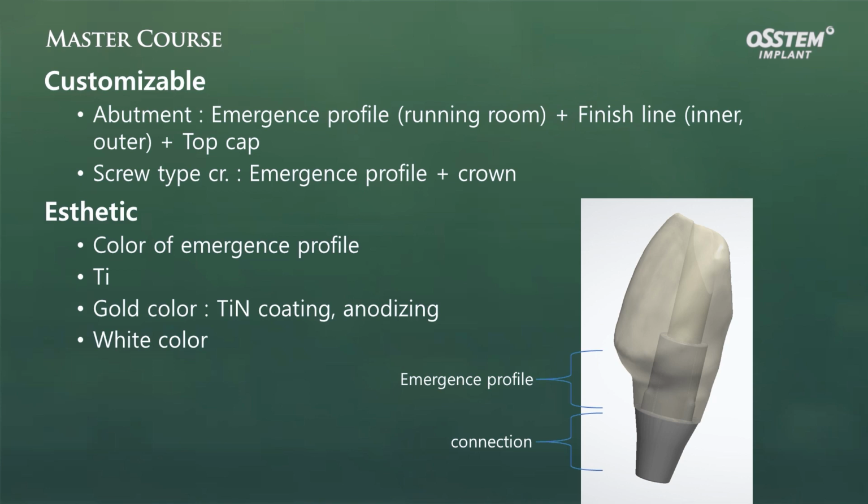Then you can have a gold color, and sometimes you do it with a white color, in other words, a zirconia abutment or porcelain can be used.